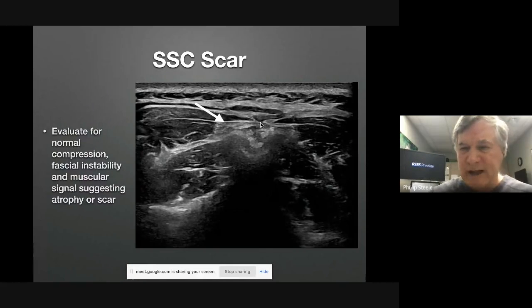So the more you start scanning, the more you start realizing that some of these areas will have scar tissue formed. So trap, Splenius Capitis, Semispinalis Capitis. Here's the Nuchal Raphe. You can see that the muscles come together nicely here. Trap on this side is asymmetric. Something's going on. And we have scar tissue here. So there was an old whiplash injury, and this part's all unstable. So I'm going to come in here with Prolo the first time and then PRP towards a later date to try to help resolve this issue.